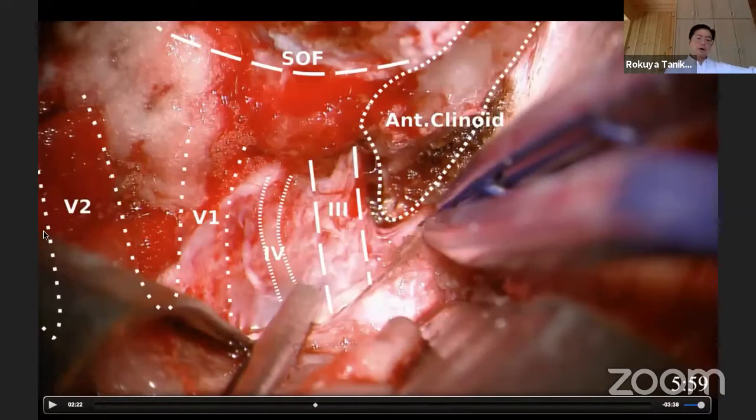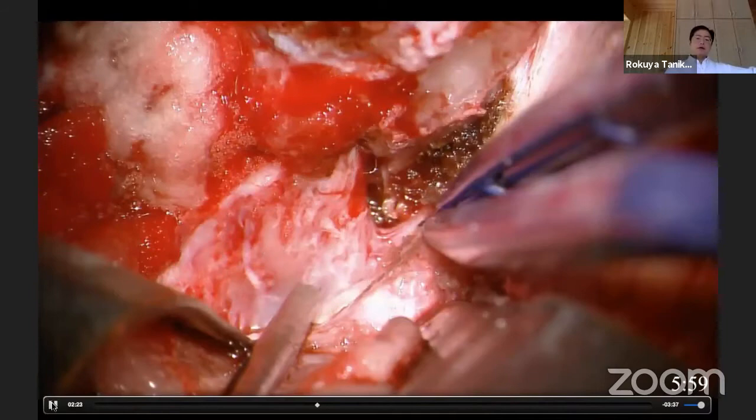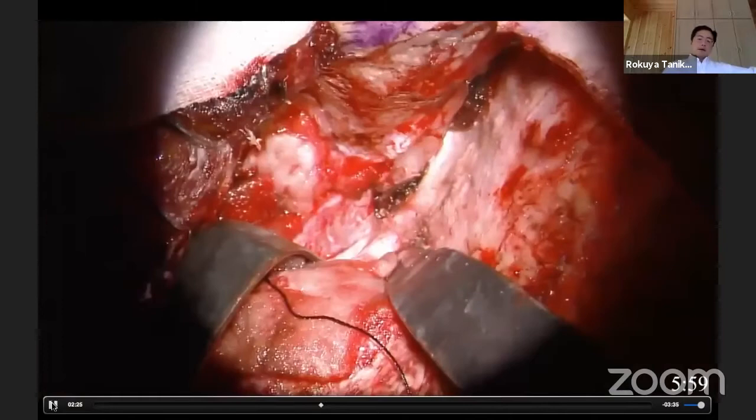You can see in the middle of the operative field the first knob of the trigeminal nerve can be identified from here. This is very important anatomy: here is the anterior clinoid process, the superior orbital fissure, the third cranial nerve, the fourth cranial nerve, V1 and V2. Here is the anterolateral triangle, partially opening the lateral cavernous sinus wall.